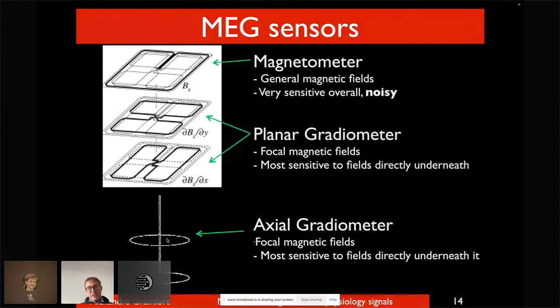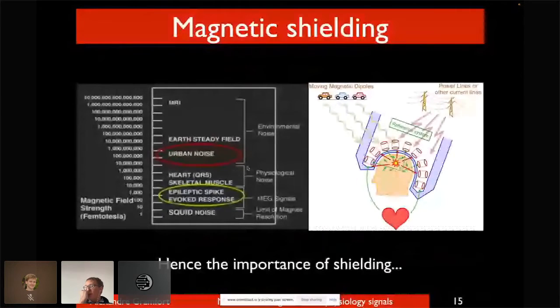What is important to understand is that when you collect EEG and MEG, what you see in the signals is actually mostly noise, and the true signal from the brain is dominated by the noise, at least on the raw signals, or at least very close to it. So the issue is that these modalities are sensitive to so-called physiological noise and peripheral noise.